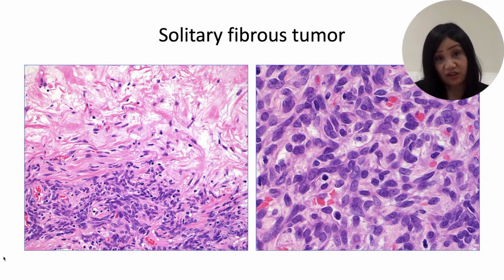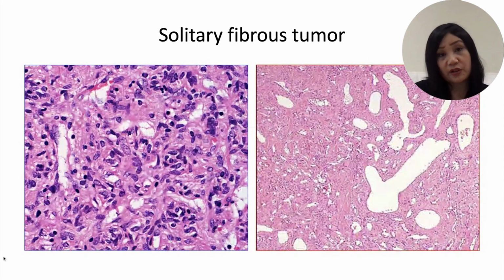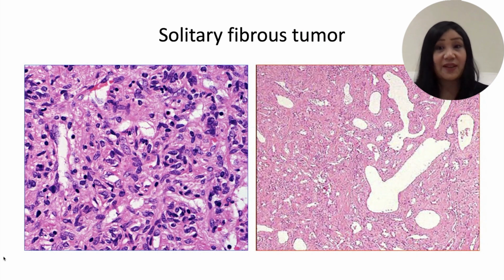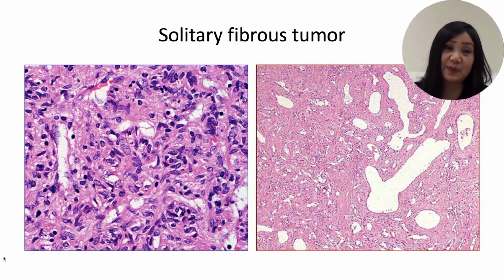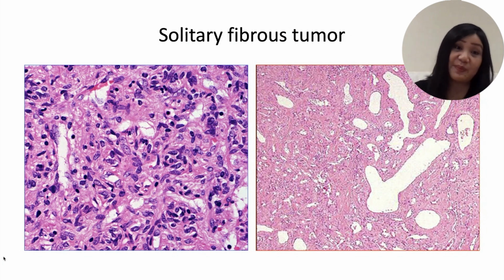The fibroblast population of solitary fibrous tumour is frequently just a little more spindled than the very classical ovoid short nuclei of spindle cell lipoma. Solitary fibrous tumour also frequently has this very pronounced HPC, so hemangiopericytoma-like vascular pattern of angulated thin-walled vessels, which is lacking in myxoid spindle cell lipoma. And spindle cell lipoma will lack the classic NAB2-STAT6 fusion of solitary fibrous tumour. SFT is also diffusely positive in nuclei for STAT6, which is again lacking in spindle cell lipoma.